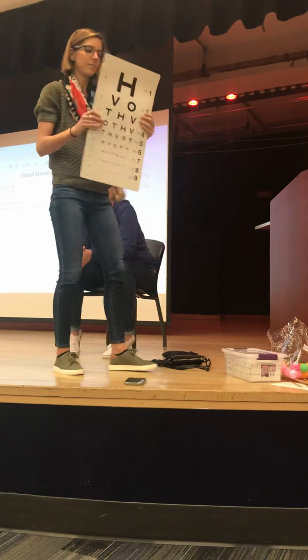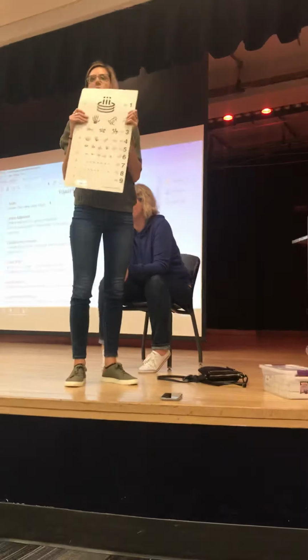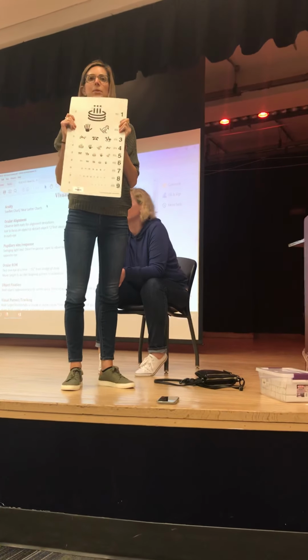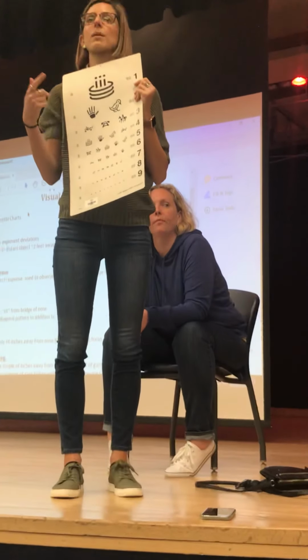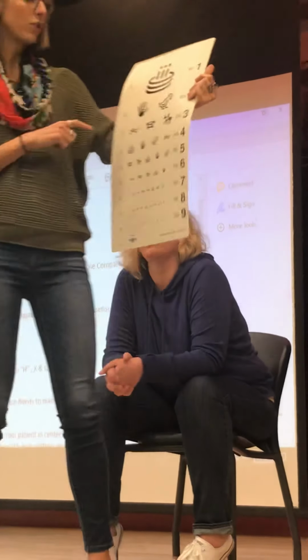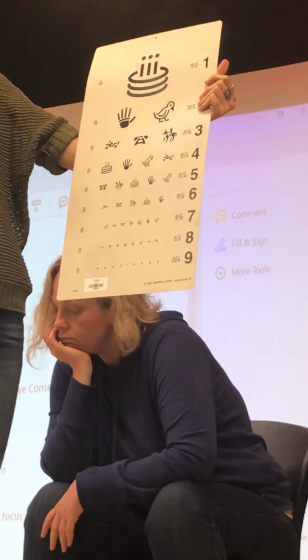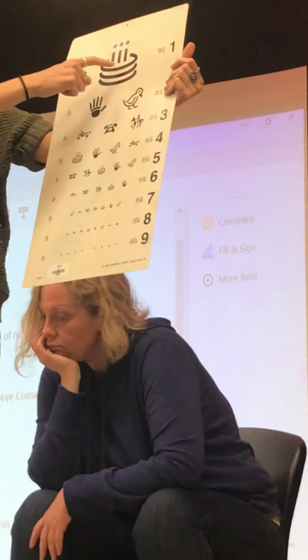This is the Snellen chart. This is an acuity chart that's done with symbols. So this can be good for children as well as people who are aphasic, unable to speak, but able to follow directions to the point where if I show them this and show them the examples or the choices of all these pictures, they're able to point to which picture.